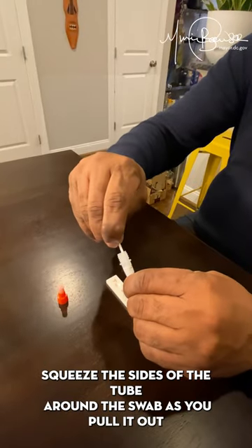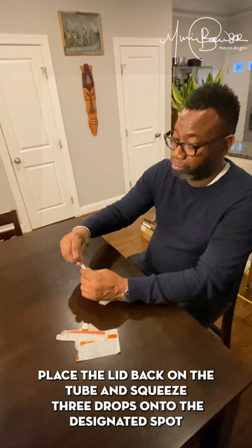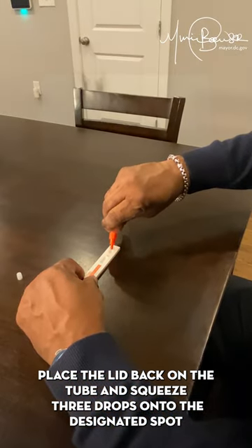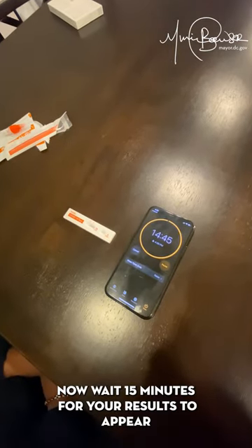Squeeze the sides of the tube around the swab as you pull it out. Place the lid back on the tube and squeeze three drops onto the designated spot on the testing card. Now wait 15 minutes for your results to appear.